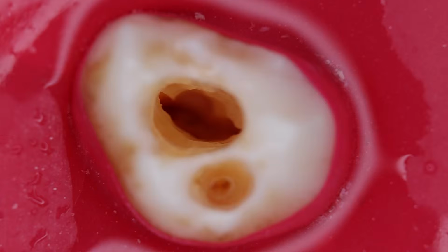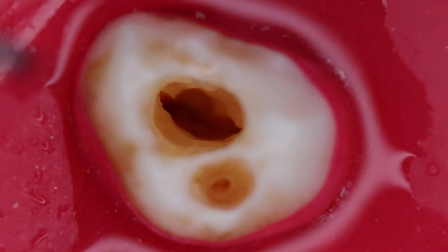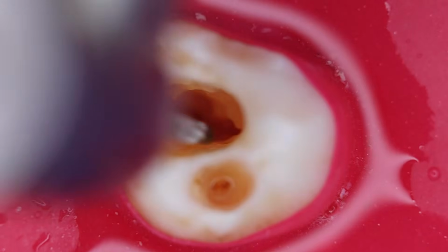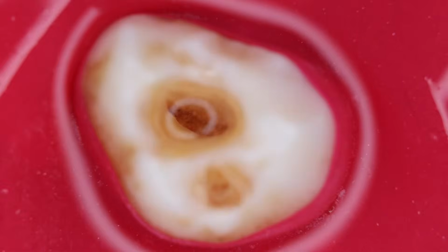Once we have identified the orifices, this is the time we can refine these undermining structures that are there, so that we can remove these things. That's all.